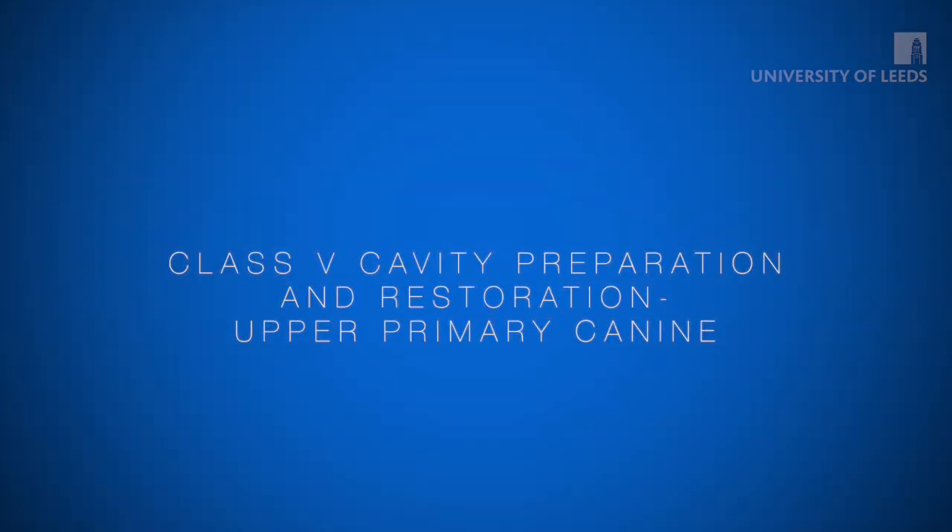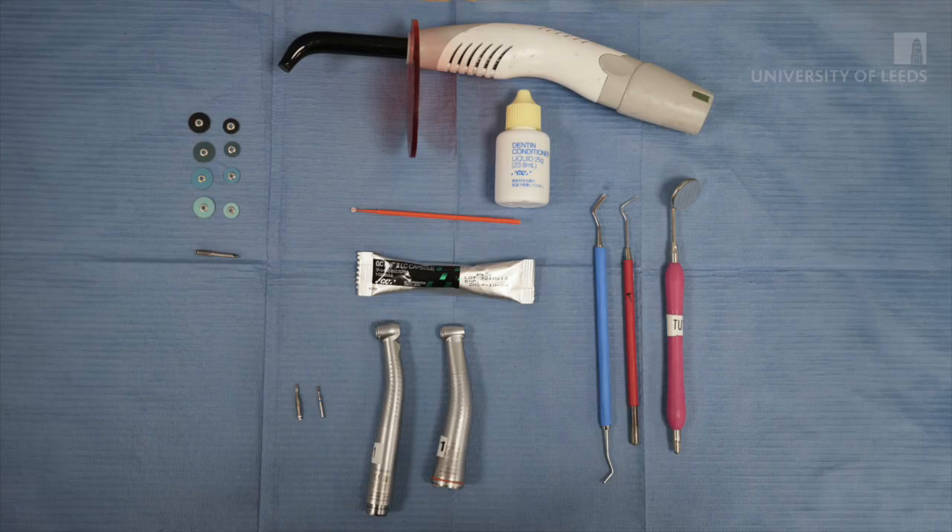This video demonstrates how to prepare and restore a class 5 cavity on an upper primary canine. You will need a round or pear-shaped friction grip diamond bur, high and slow speed handpieces, mirror and probe, flat plastic, curing light, dentine conditioner and resin modified glass ionomer cement, and finishing burrs and polishing discs.